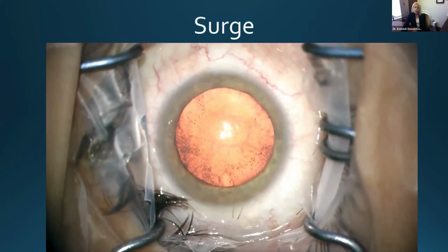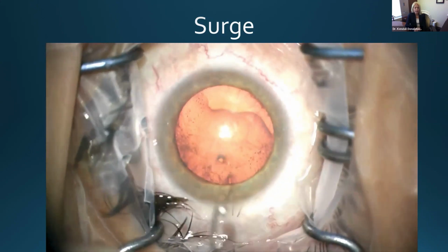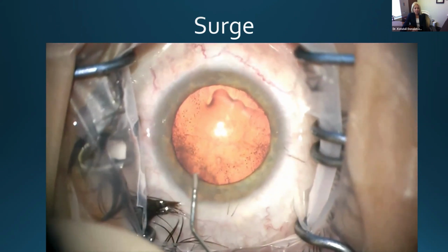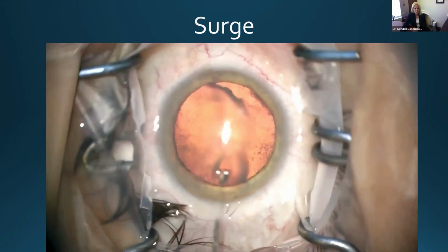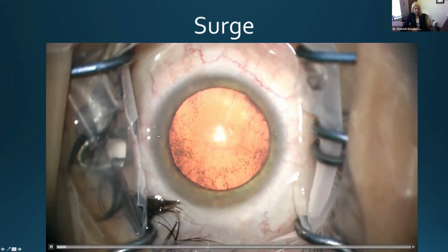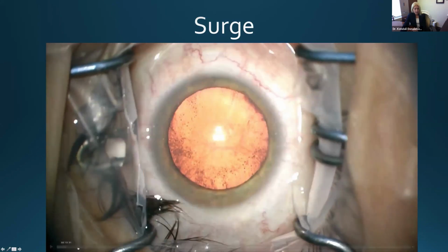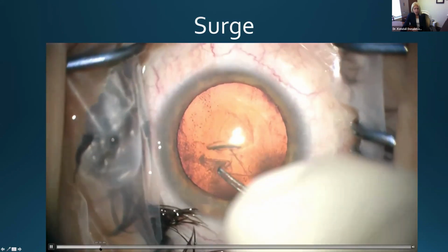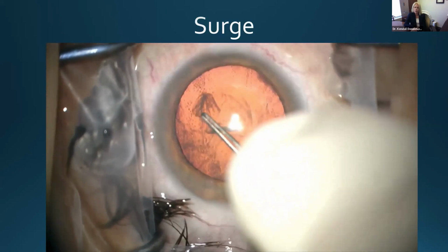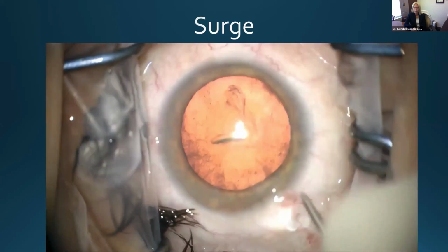So this is actually a video that I got from Barry Seibel, who is the author of Phacoemulsification. He's a wonderful cataract surgeon, and I could show you this entire surgery, which is really terrific. He's a great phaco chop surgeon. We can skip ahead just a little bit, and I'll show you a better example of phacoemulsification shortly. But you can see here he's doing his capsulorhexis, nice round capsulorhexis there that he's pulling around with Utrata forceps.